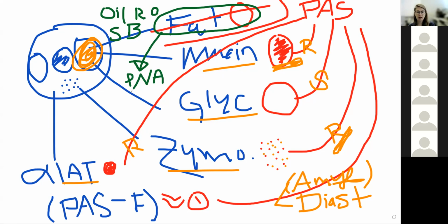Okay, so some kind of lipoid pneumonia. In neuro, do they sometimes do it? I feel like I've seen Sudan black in a histology atlas for some neuro slides. I don't really know what the utility is. For the myelin, perhaps? Yeah, for myelin sheaths, but I don't know really diagnostically if it's used.